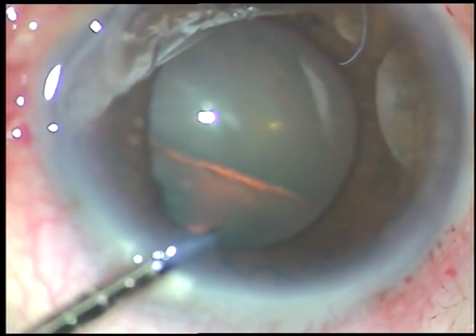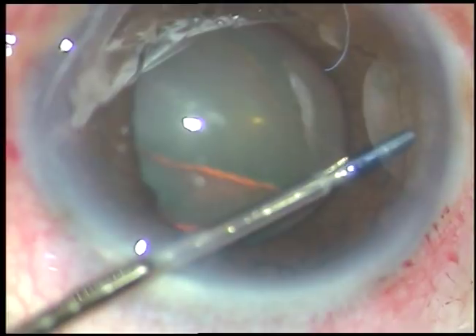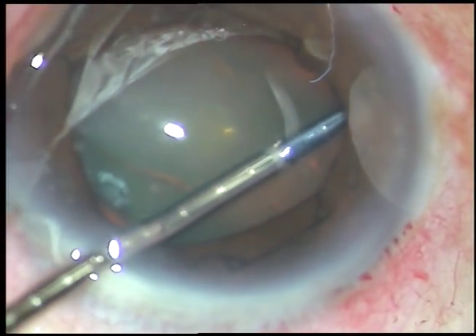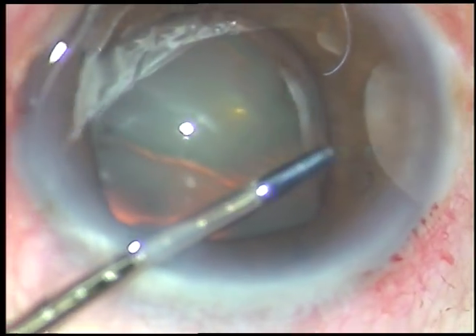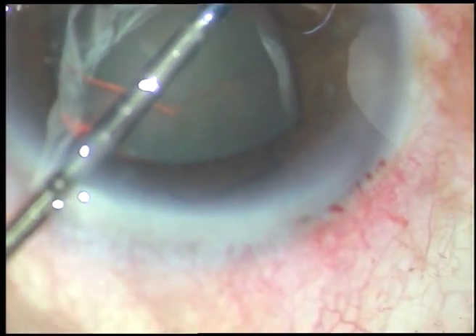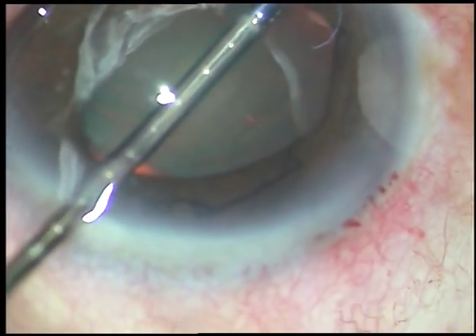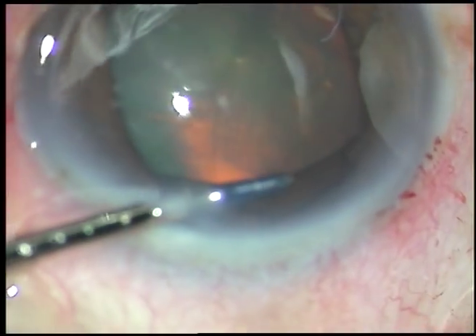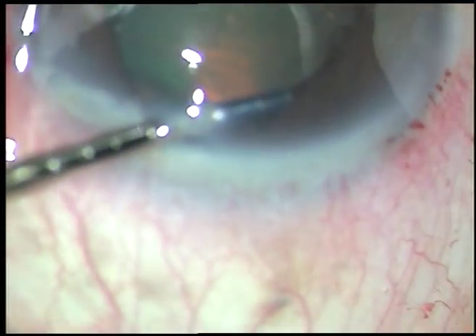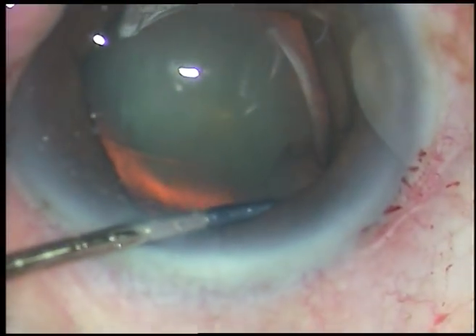Now I am tucking the flanges. I was going to tuck this flange, then I found that this is not the alternate flange. So I go to the right flange and tuck it underneath the iris.